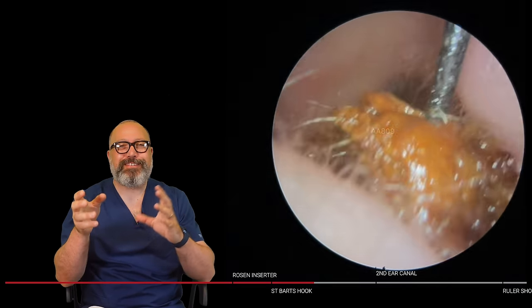I've switched down to the fine end now. I'm just literally going to take this piece at the bottom away here. There we go. Just tidy up some of these smaller, looser pieces there. There we go. We can see the eardrum.